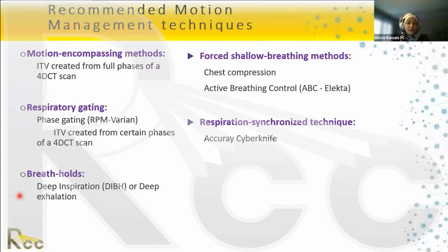Breath hold: you could either have a deep inspiration breath hold, where the patient takes a deep breath and holds it, or a deep exhalation breath hold. And here, actually, there are 2 schools of thought. Some people like deep inspiration, others like deep exhalation, and we're going to see why. Maybe it makes sense or is intuitive to think inspiration is the way to go. People's lungs are filled with oxygen, so why do I want to have a breath hold when I'm out of oxygen? Doesn't make sense. But I'll show you with data that it's actually better than deep inspiration.